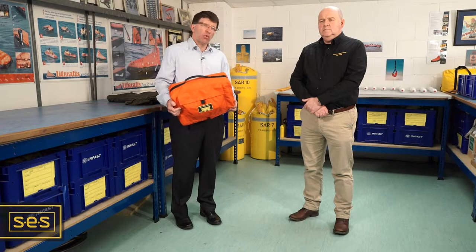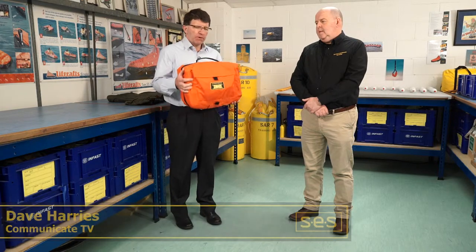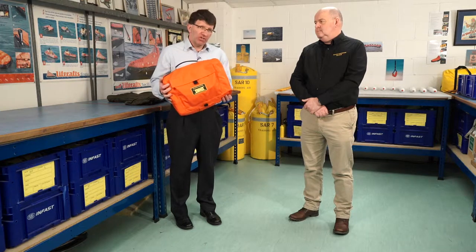I'm here today at Survival Equipment Services with Del Hall, the Managing Director, and he's going to show me a remarkable product that they've developed, which is effectively a stretcher in a bag. Looking at this bag, it's a little hard to believe there's a stretcher in here, so perhaps you could demonstrate this for me.